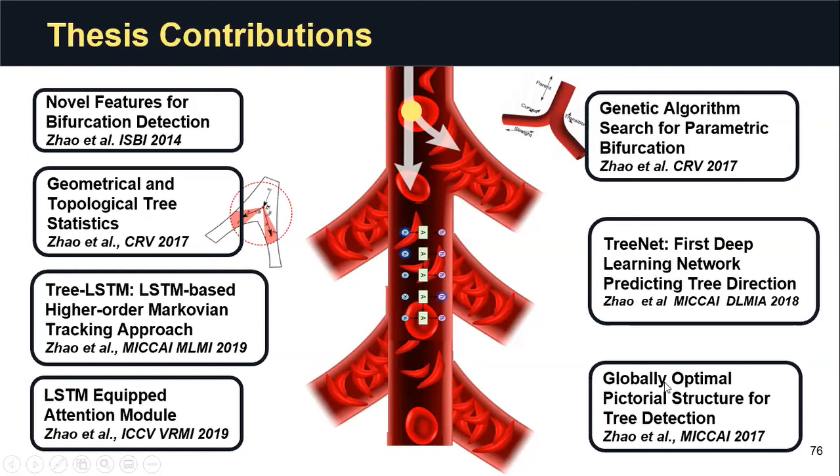And then we use global optimal pictorial structure for tree detection. And then eventually we equipped the attention module with vasculature prior, which is encoded in LSTM.